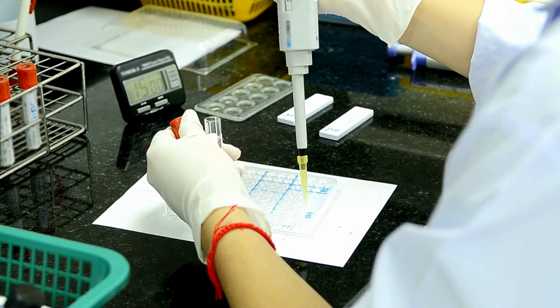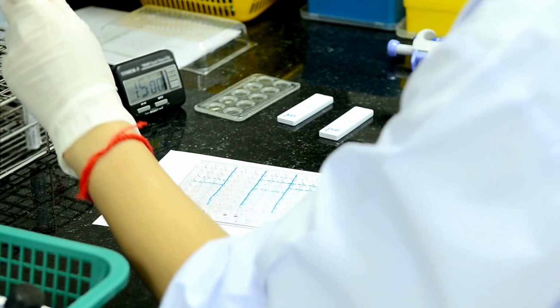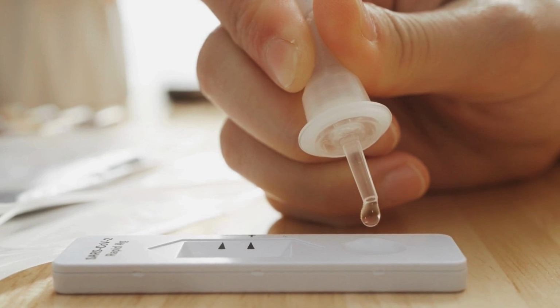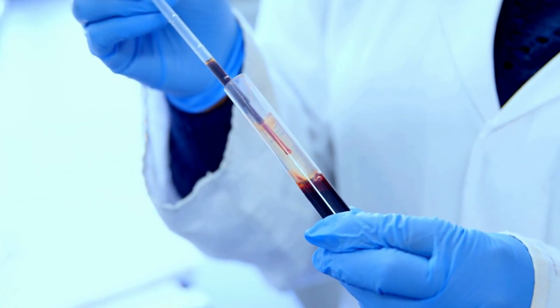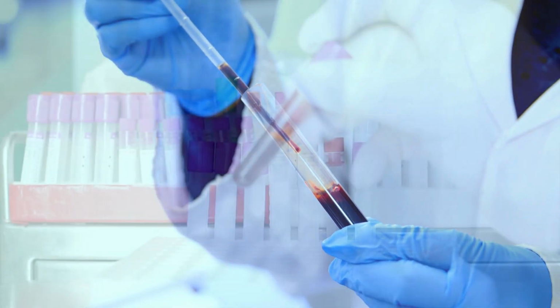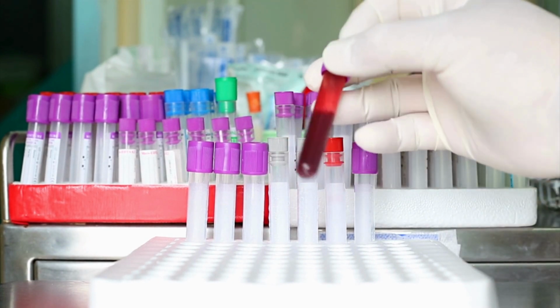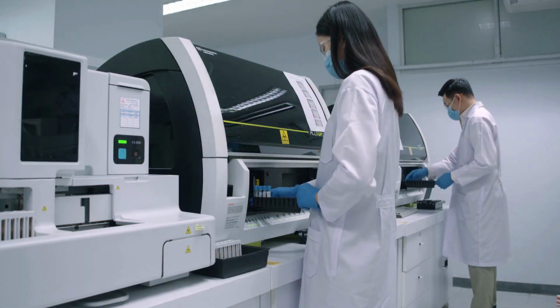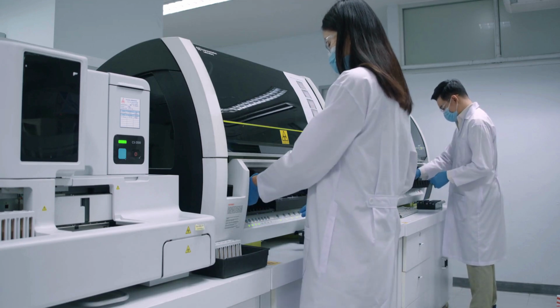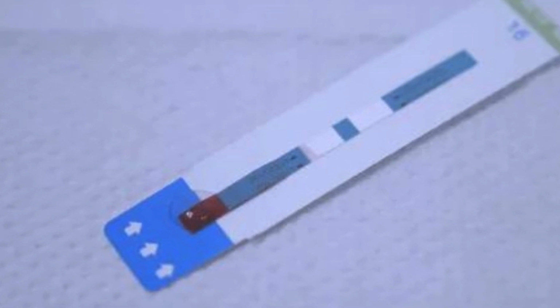In conclusion, HIV test strips represent a significant advancement in HIV diagnostics, offering a quick, accessible, and relatively accurate method for HIV screening. While they have revolutionized early detection and expanded testing accessibility, it's crucial to understand their limitations and the need for confirmatory testing of positive results. As technology advances, these tests continue to improve in sensitivity and specificity, playing a vital role in global HIV prevention and treatment efforts.